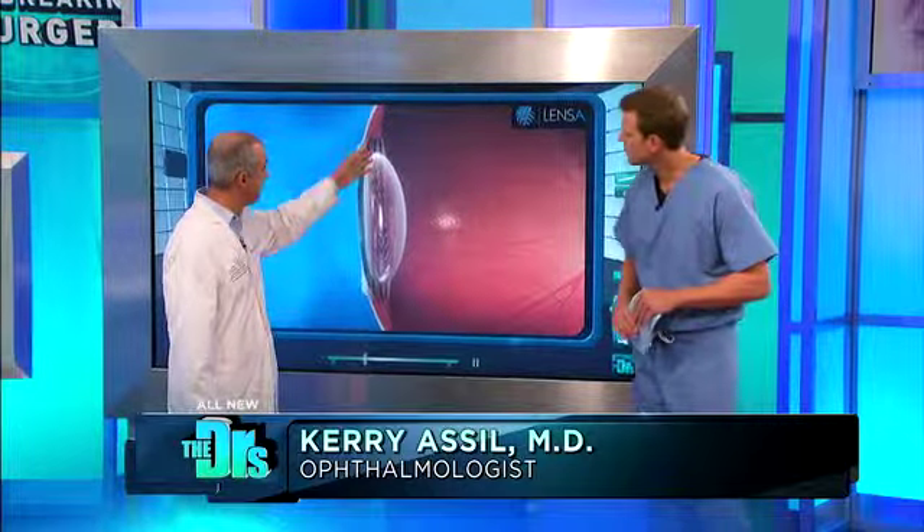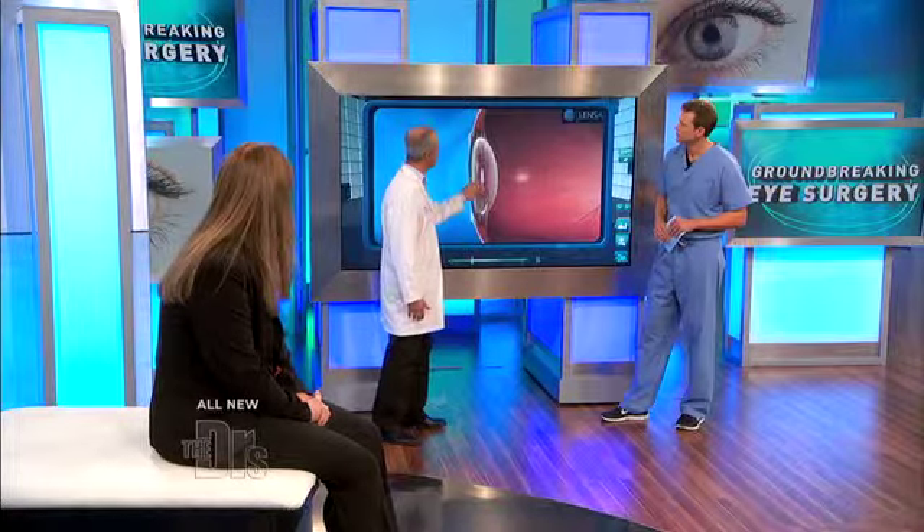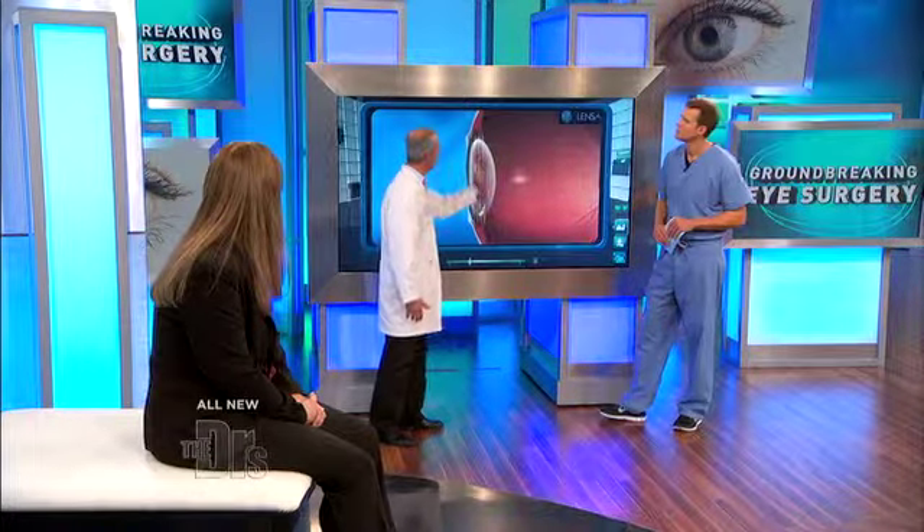Here we have an example of where the lens would lie within the eye. This is the outer lens of the eye. When we do the cataract surgery, we'll take this lens that's lost its transparency, we'll use ultrasound normally to liquefy it, and then we put a replacement lens in the eye. And that's what we're hoping to achieve at the time of cataract surgery.